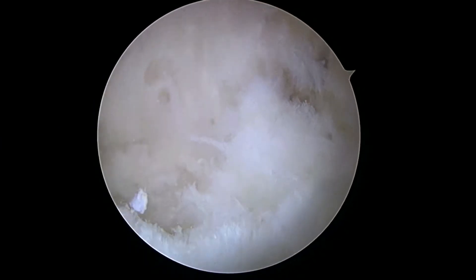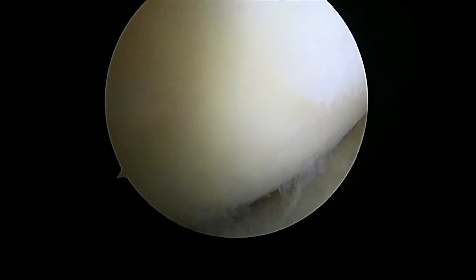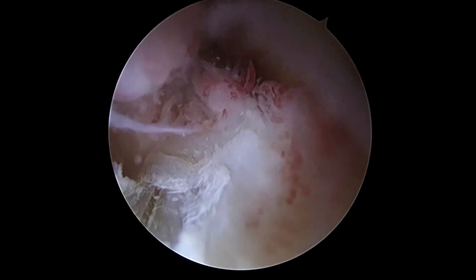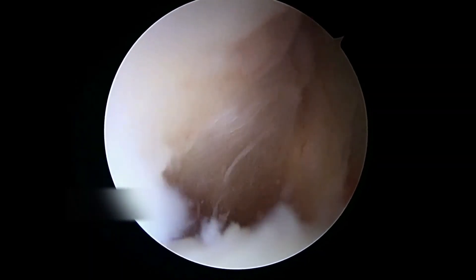Here's the back of your knee. We're looking with a 70-degree scope, so we look all the way around the corner. Just a little bit of fraying, but you don't have any more loose bodies. Here's your femoral condyle. So we're going to squeeze out of here. As we go back, there's your joint space again. Here's your PCL coming up into the bone. And as we squeeze out — this is a 70-degree scope so it's a little confusing to look at — here we are back in the front of your knee, and here's the ACL. We're going to look around the rest of it and hopefully be done soon.